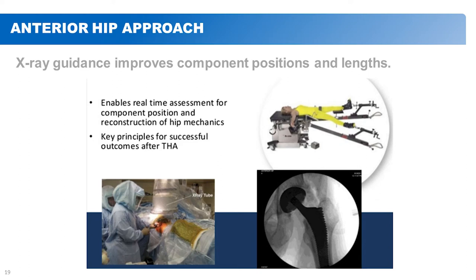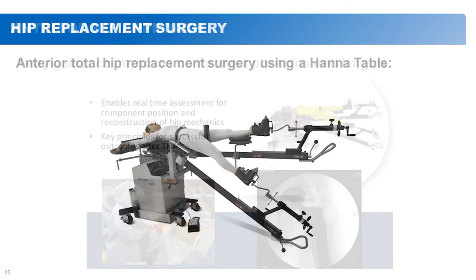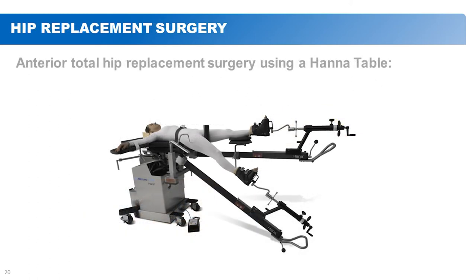You can see the patient lying there on that table. So she's lying on her back. And then this table, what it does is it hooks in and allows us to extend the hip. So we're actually putting the foot, you can imagine, down towards the ground and then turning the ankle outwards. And that enables me to pop the hip joint up through the front so I can access it and get a successful anterior hip replacement. So technology has helped. This is another view of that table, which has really revolutionized things. I first started doing this along with a surgeon, Dr. John Beaver, here in Northern Kentucky.